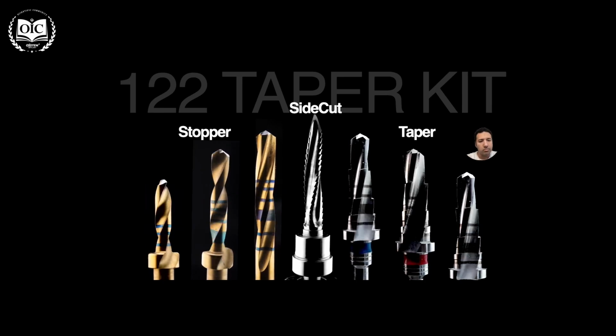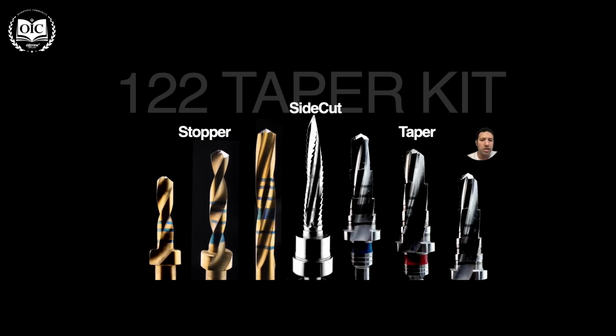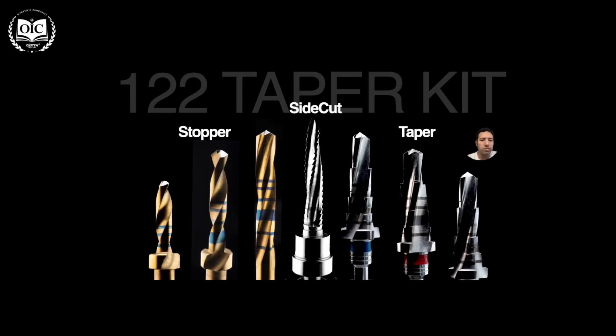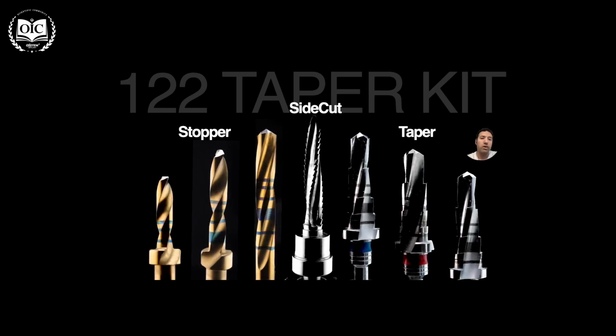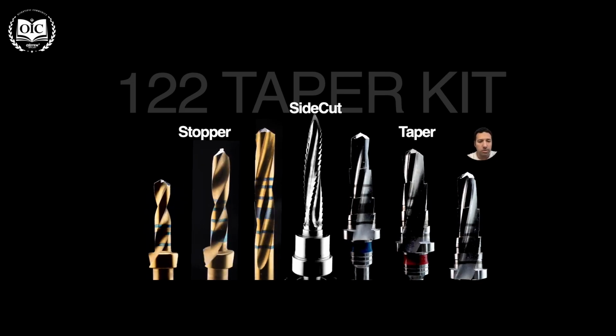Actually, the side cut drill is something that I hope the Osstem R&D will add to the OneGuide Kit. It's a pretty useful tool, very sharp and sturdy, easy to use. I use it with every drilling protocol. Even if I'm working with the OneGuide Kit, I always start with this side cut. Then I go to the taper drills.